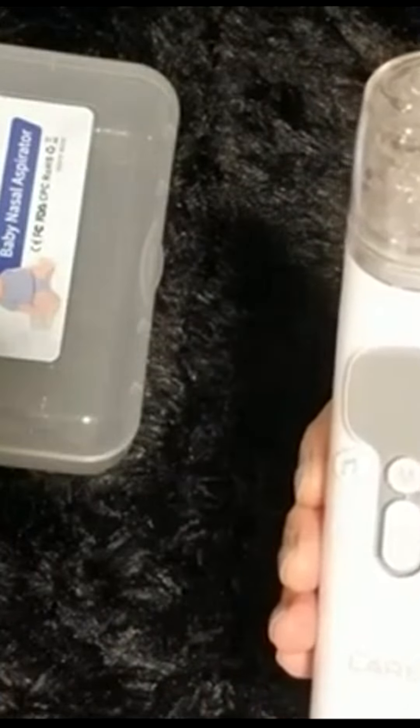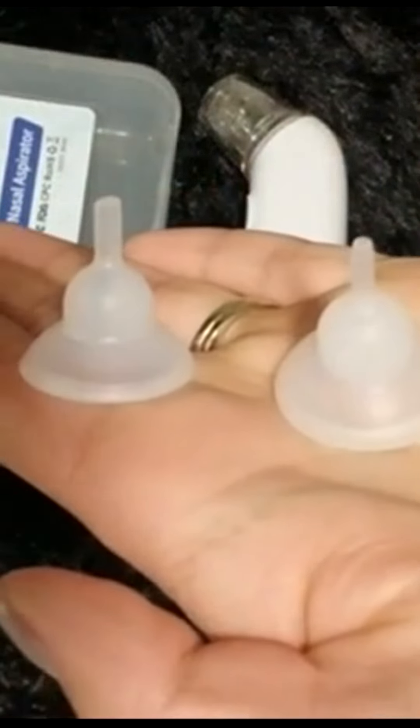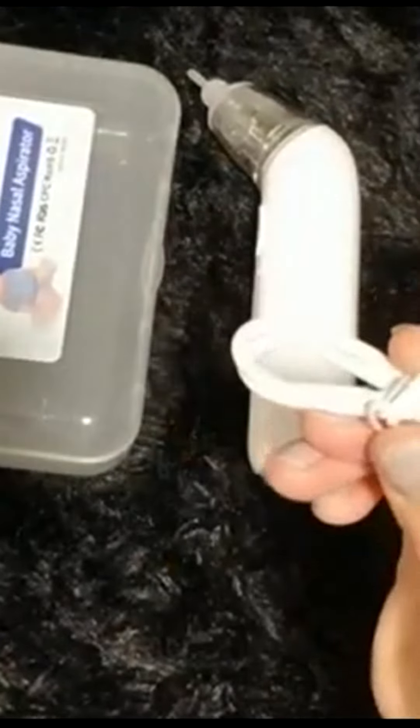There are three nozzle options: the round nozzle, the narrow round nozzle, or the needle-shaped nozzle. You can pick whichever you prefer for your child. We're using the needle-shaped nozzle — it just suctions right on top. On the bottom there's a USB port you can use to charge it.